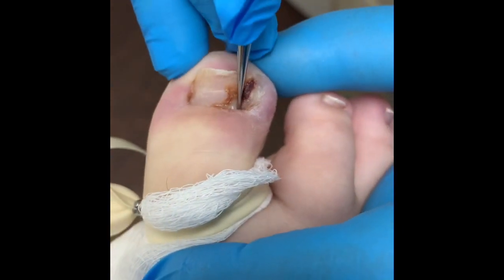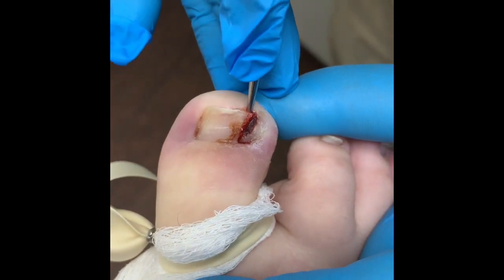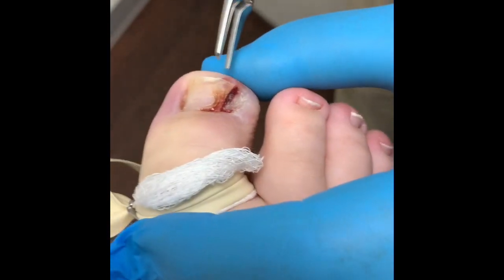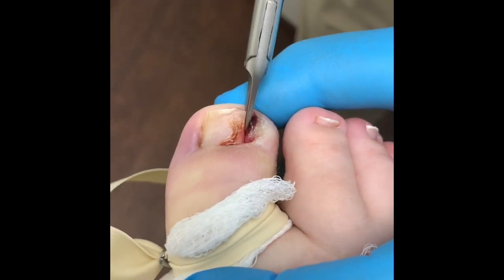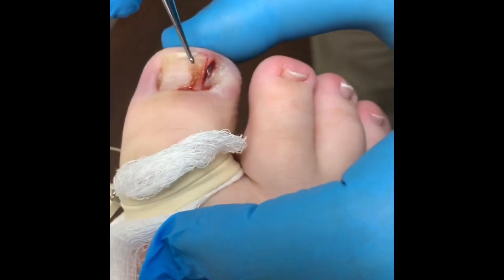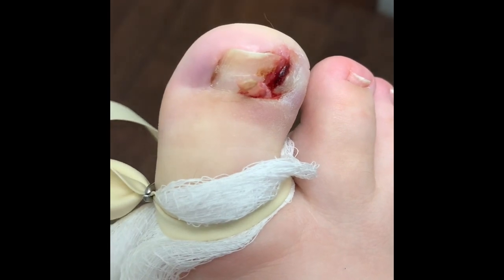Jordan, you feeling any of this? All good. This is gonna be a big piece in there — this is a big piece. What's nice is that all the doctors have different techniques.